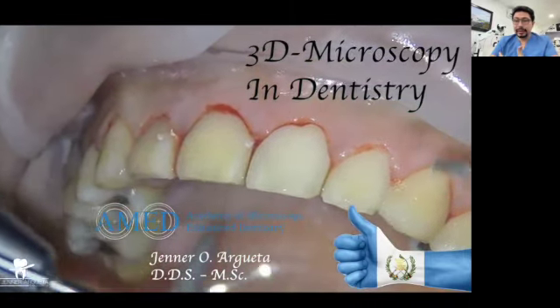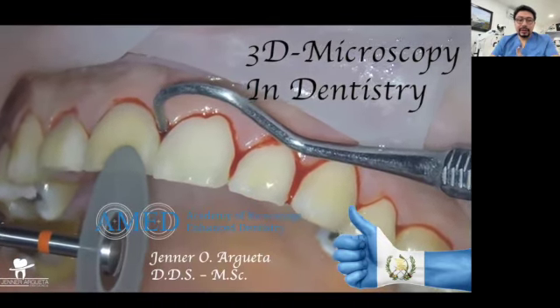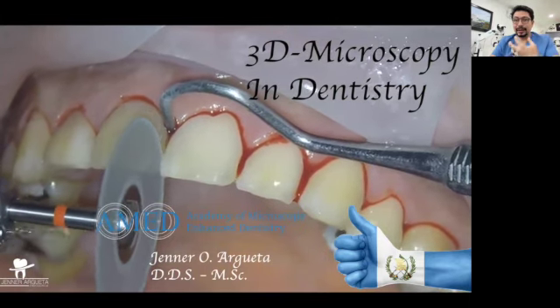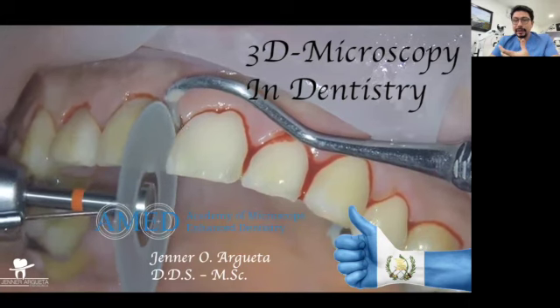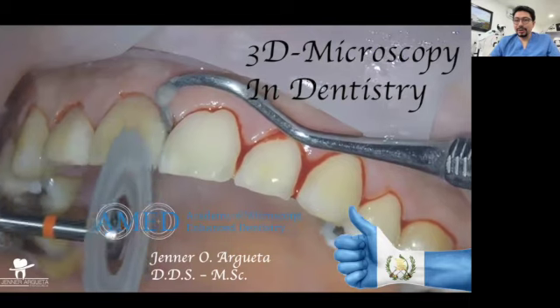It's the first thing that we have been working on since a few years ago, trying to transmit this idea, because it is true that endodontics is the specialty in which the microscope was introduced in dentistry, because working inside of the root canal system is not easy.